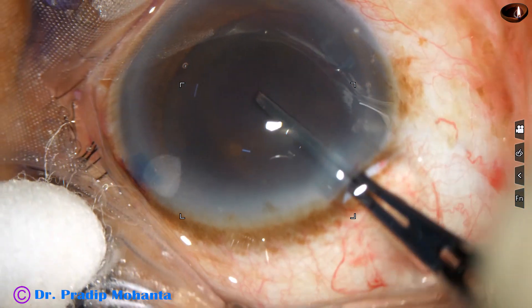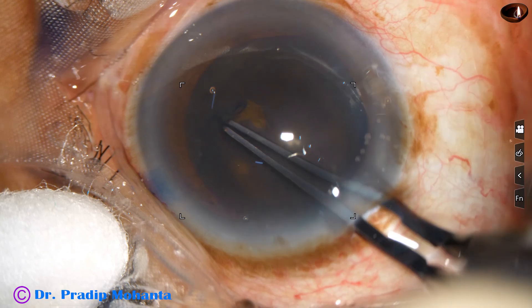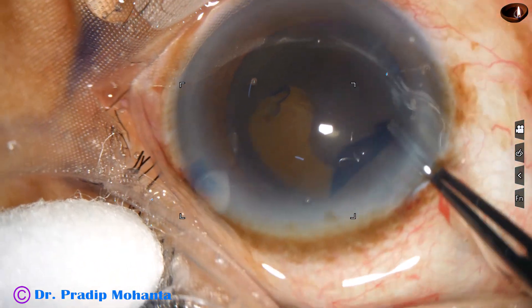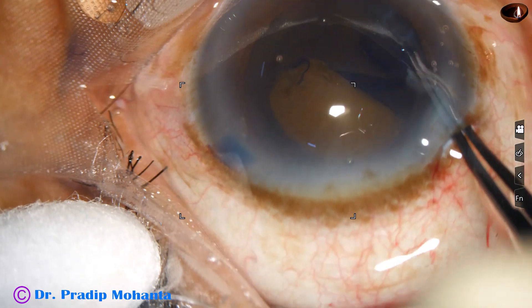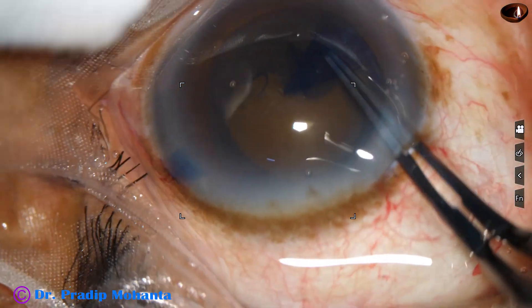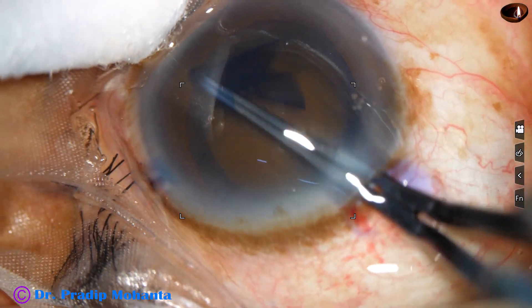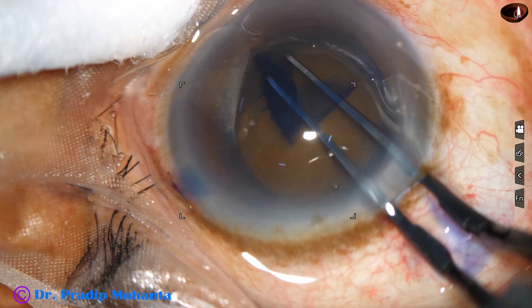2% hydroxypropylmethylcellulose is injected into the anterior chamber and applied over the corneal epithelium for better visibility. A capsulorhexis forceps — utrata forceps — is used for capsulorhexis. In hard cataracts, I always do a large rhexis. When you do a large rhexis, management of the fragments becomes easier and stress on the zonules becomes less.